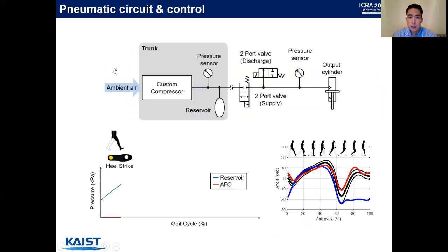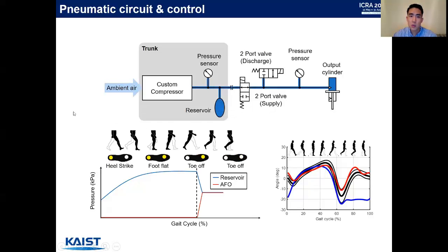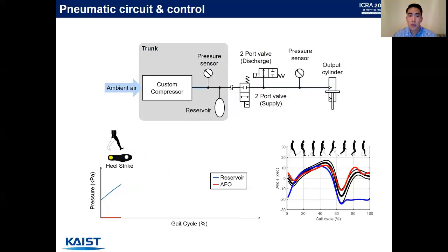The pneumatic circuit is as follows. On the trunk, there is the custom compressor, a pressure sensor to monitor its pressure, and a reservoir where air is accumulated. On the foot, there are two solenoid valves, a pressure sensor, and the output cylinder. Drop foot patients only require assistance during the swing phase and the initial contact, so the basic control concept is to accumulate air during the stance phase where no assistance is required.